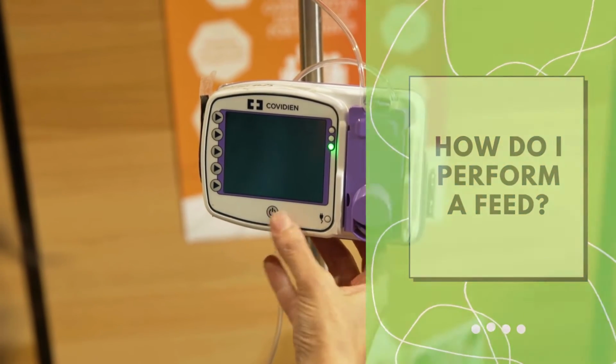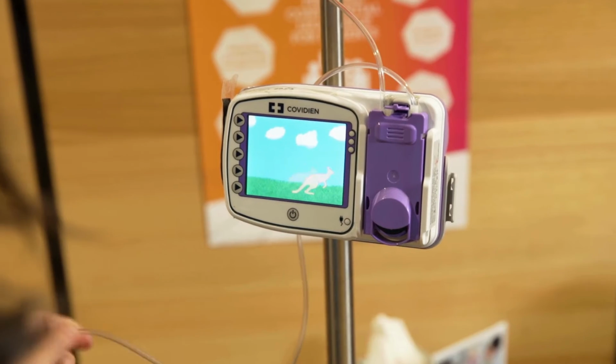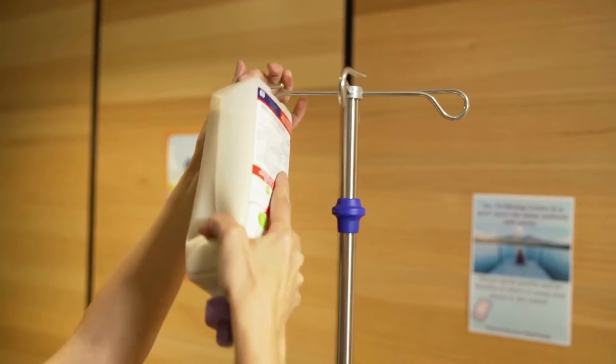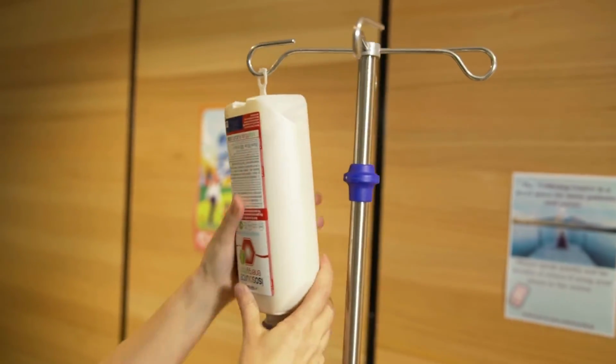Once you come out of surgery, before you're going home, the dietitian and the nurses will be there to help teach you how to do the feeding. When you perform your feed, you'll need the following: a syringe, the pump, a pole, your formula, and your spike set.